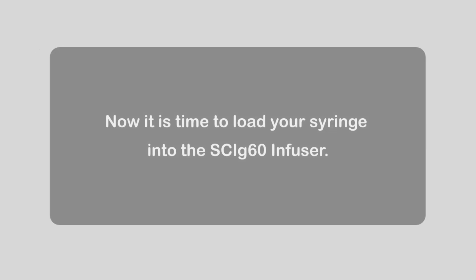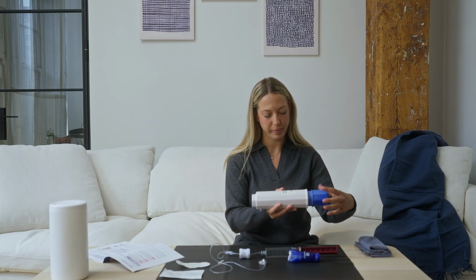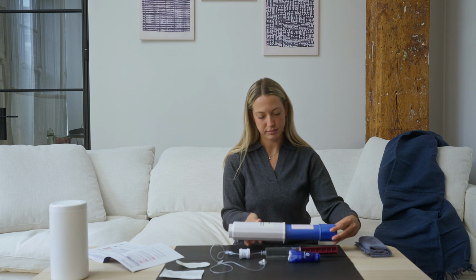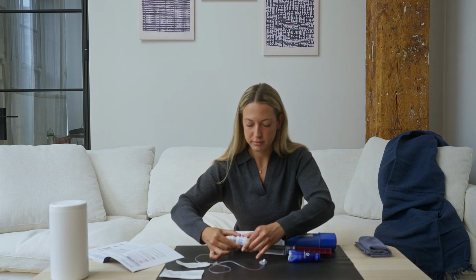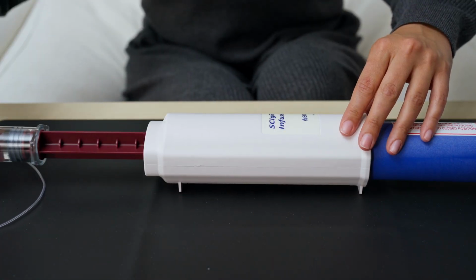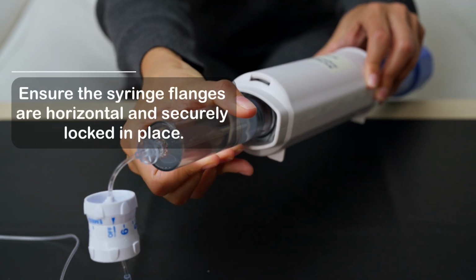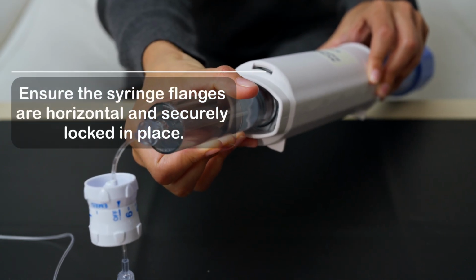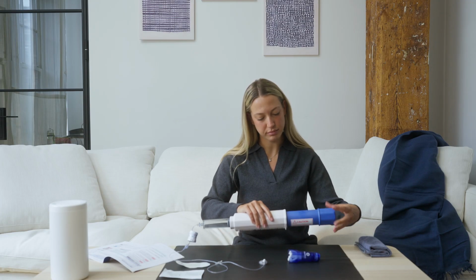Now it is time to load your syringe into the SCIg60 infuser. Hold the pump to untwist the blue knob until fully open. Ensure the flow rate controller is set to the off position to prevent an early start to your infusion. You will now load the syringe into the pump with the graduated numbers facing you. Ensure the syringe flanges are horizontal and rotate clockwise to securely lock the syringe in place. Twist the blue knob to the closed position.